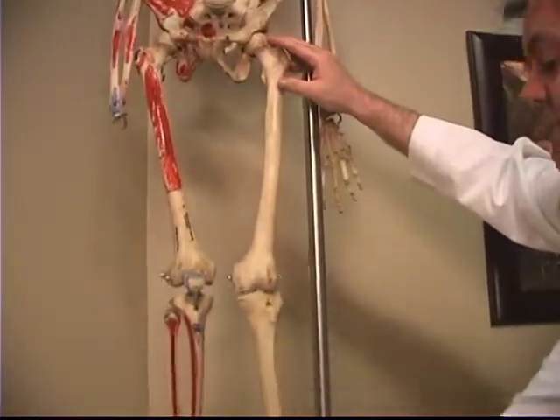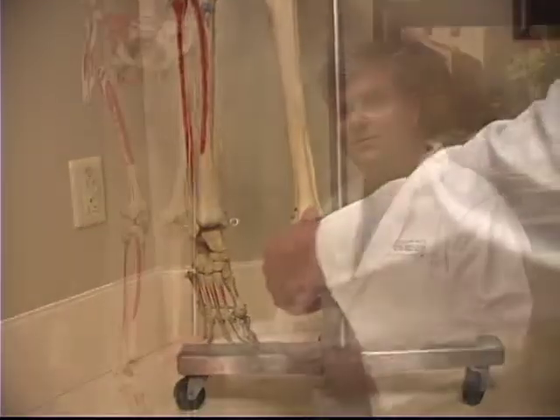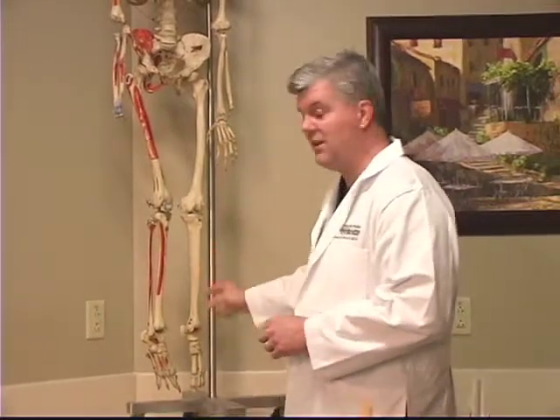There's a lot of variables that go into replacing the knee. We have to define what these variables are and find a reference system. The reference system that we follow with the computer-assisted surgery that we do is looking at the hip, knee, ankle alignment. We have to define exactly where the hip and the ankle and the knee are in space.